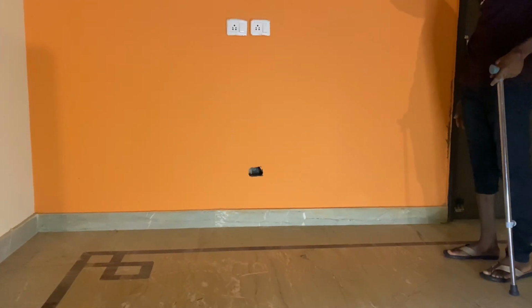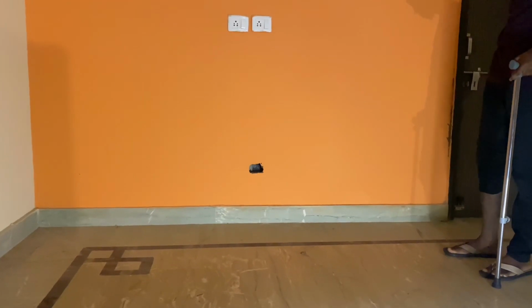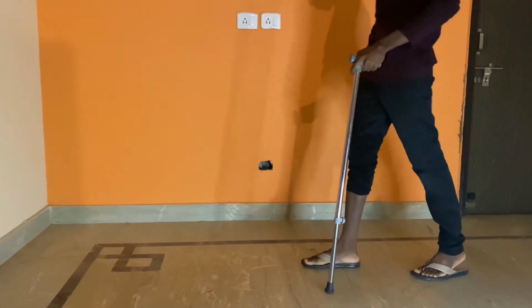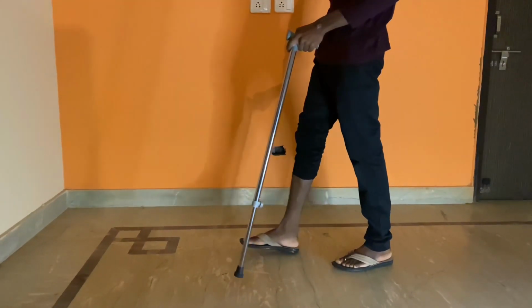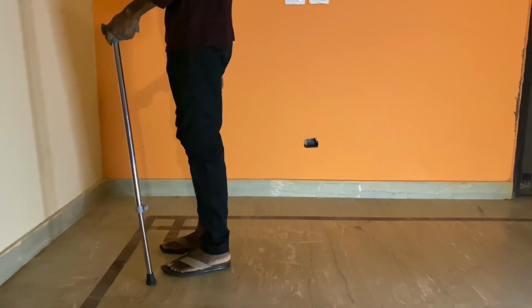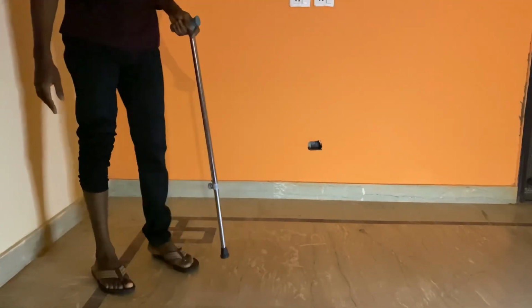Gait pattern using cane. The stick should be placed forward at the same time as the affected leg, then the unaffected leg follows. Let's demonstrate it using our patient. The cane together with the affected leg, then the unaffected leg. The cane together with the affected leg, then the unaffected leg.